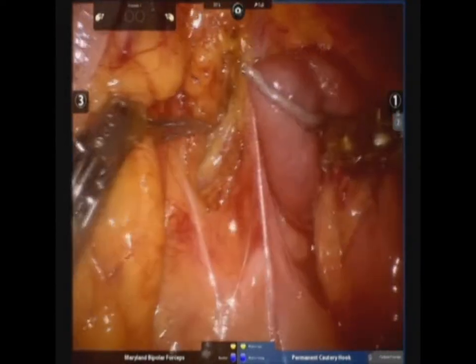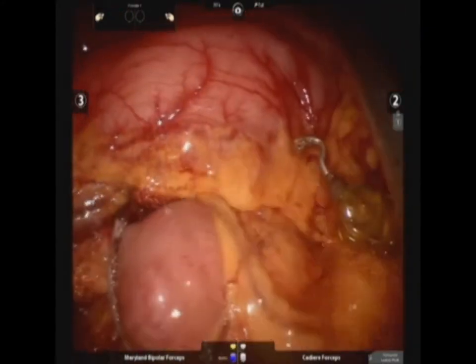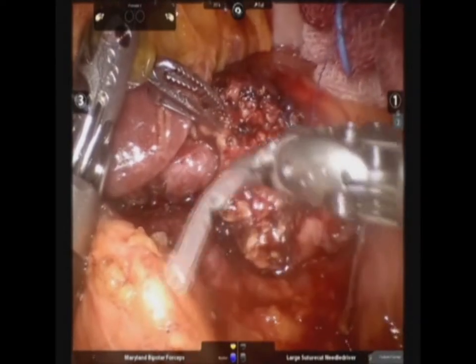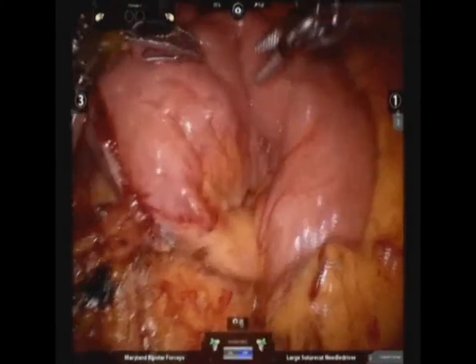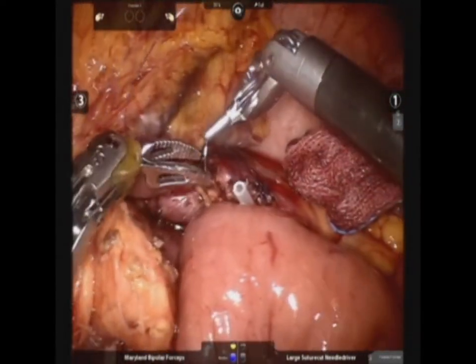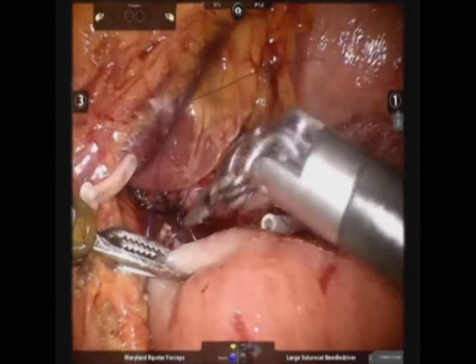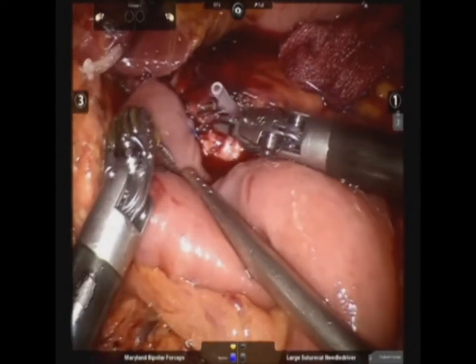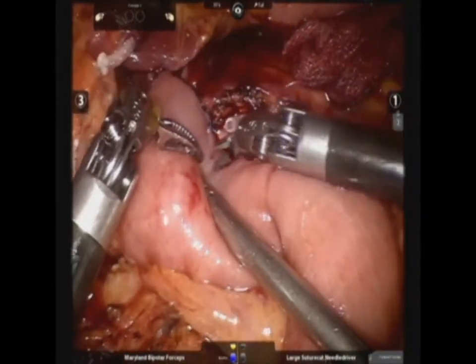The distal jejunal limb was pulled up through the mesocolon and placed alongside the distal pancreas. A short silicone catheter was inserted into the pancreatic duct and pancreaticojejunostomy was made. Posterior outer sutures were performed first.